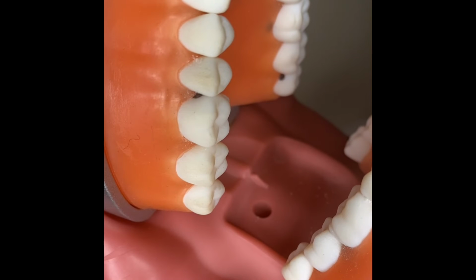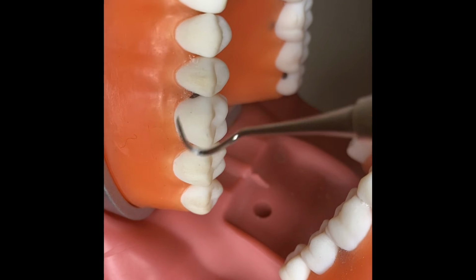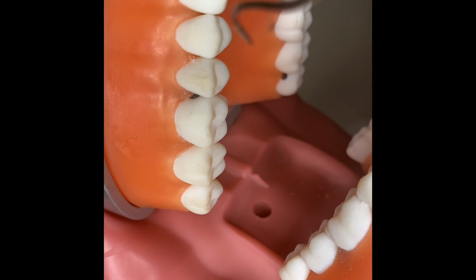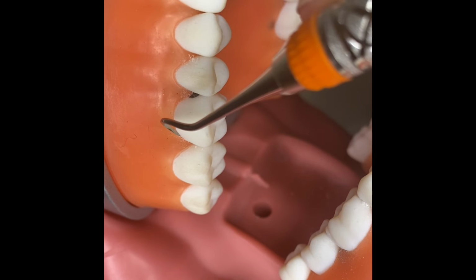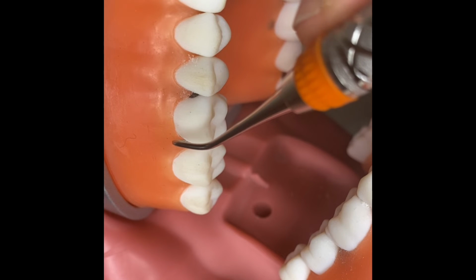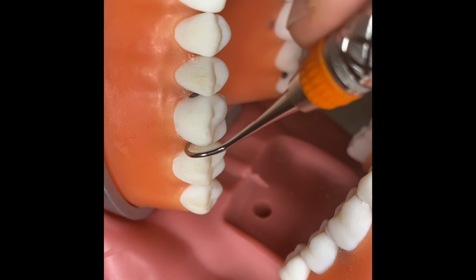I'm going to do the buccal surfaces of number 3 and 4. I'm going to choose the correct working end. The working end hugs the mesial surface of the tooth. I'm sitting at the 8 o'clock position. I'm starting side to side, pivot, roll, up, down, down.